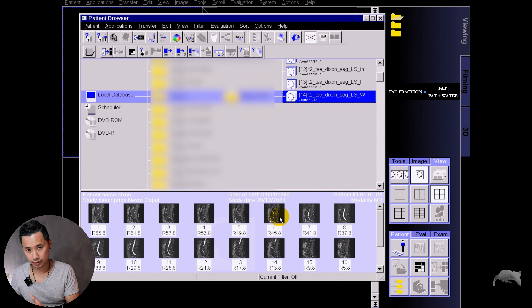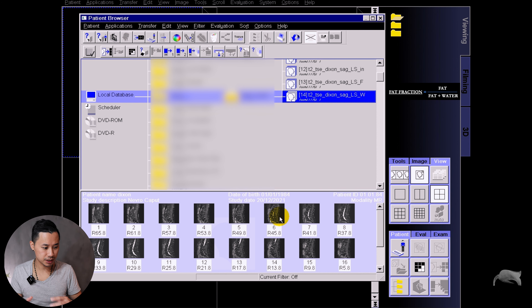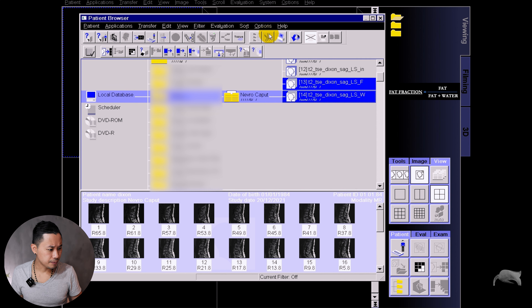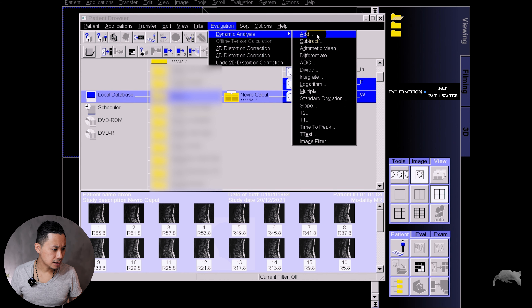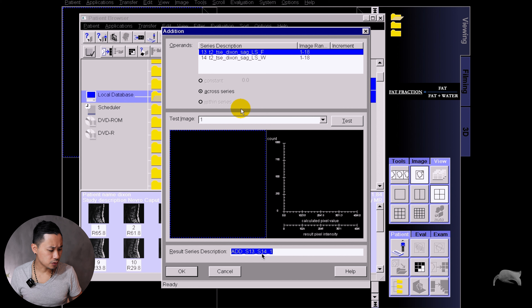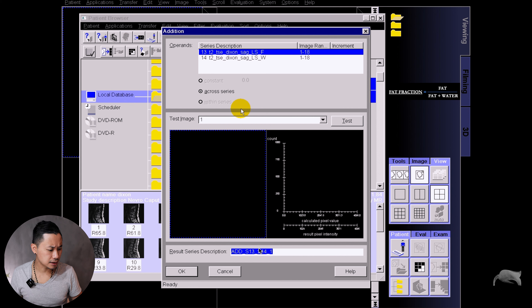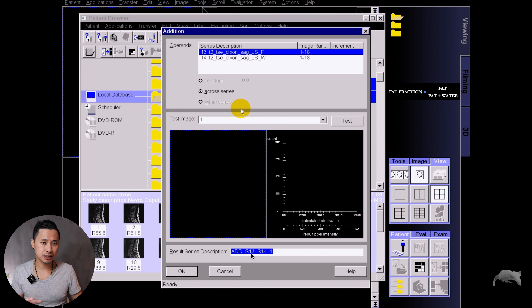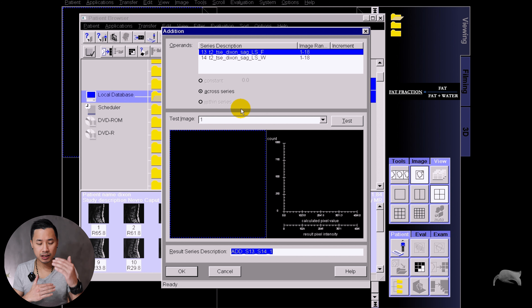Okay, now we're good to go. Now we're going to get the fat quantification first. The formula says that you're going to have fat divided by fat plus water. So how can we apply this on the scanner directly to get the quantification?